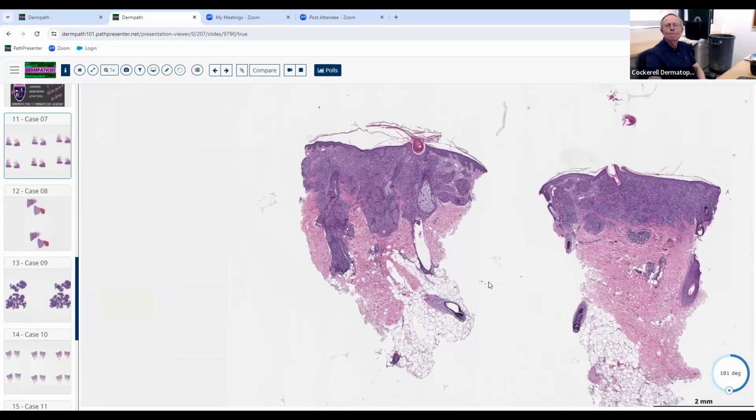So what's the pattern that we see here? Well, notice that's involving virtually all of the dermis in this area right here. So if they had done a saucerization biopsy like here, everything would be involved. And notice it's also got little nodular aggregations here. So this is a nice example of nodular and diffuse dermatitis. That's one of our 9 patterns, nodular and diffuse.